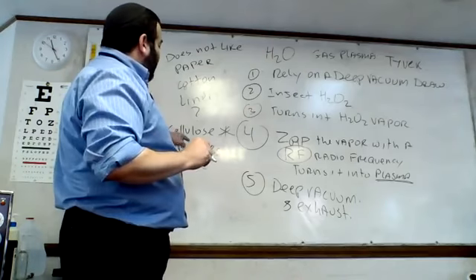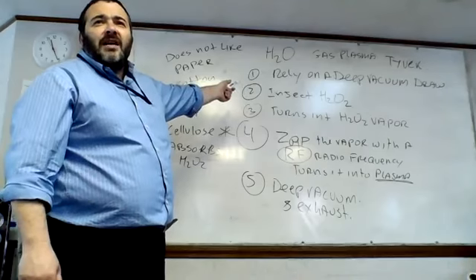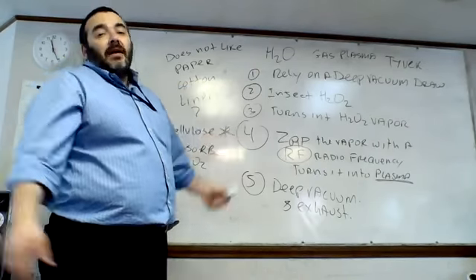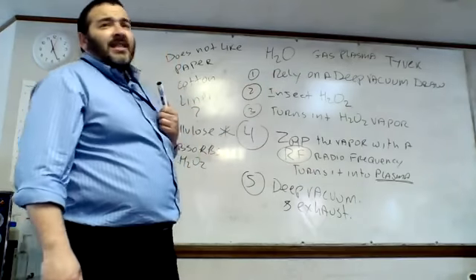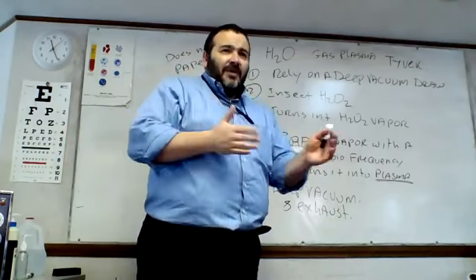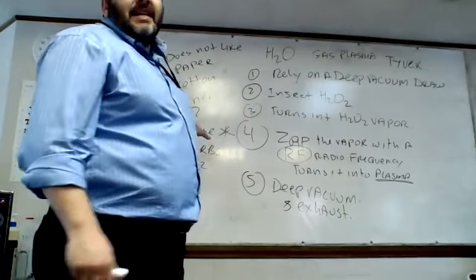So cellulose absorbs H2O2. If it absorbs H2O2, how good is it for us? It prevents contact, right? That's why we use Tyvek. Tyvek doesn't absorb anything, but has these properties that let the sterilant in, let the sterilant out, and then protect the instruments. It's really good. Does this make sense?